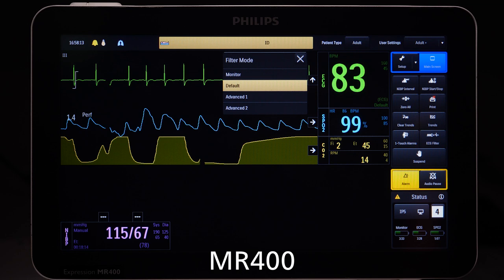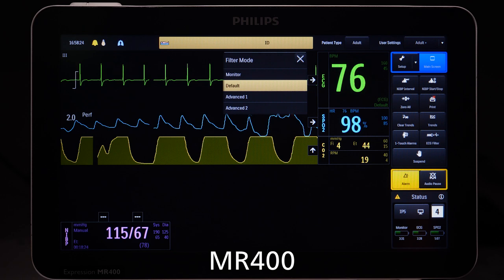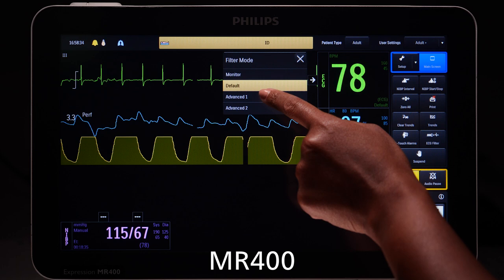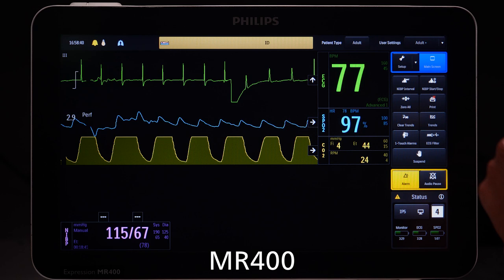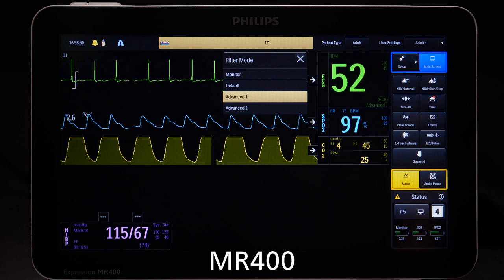Advanced 1 filter provides the best performance for more challenging MRI sequences, such as neurological and cardiovascular scans. Advanced 2 filter provides an alternative for more challenging MRI sequences, such as neurological and cardiovascular scans. Cycle through the filters to determine which filter minimizes artifact. Monitor filter is a filter mode on the MR400 that is useful during patient preparation, transporting, and gathering baseline ECG, but is not meant for use during active MRI sequences. Do not use monitor filter while monitoring in the MRI room.